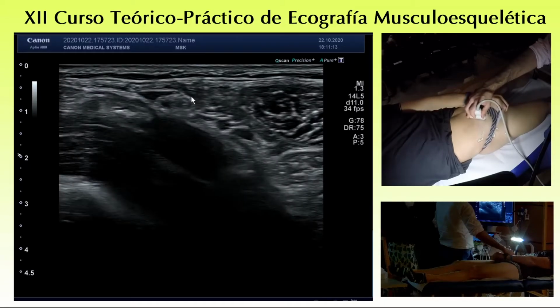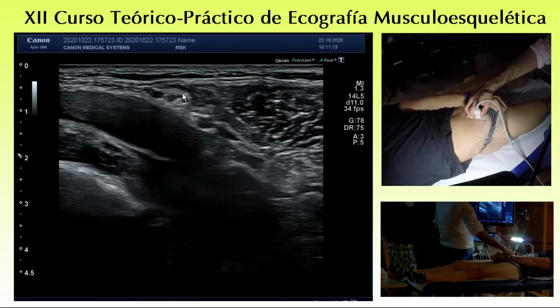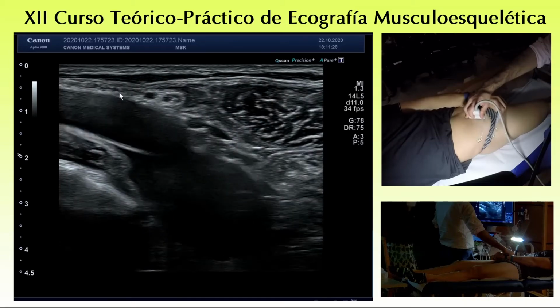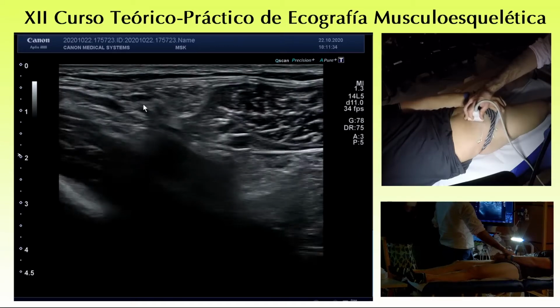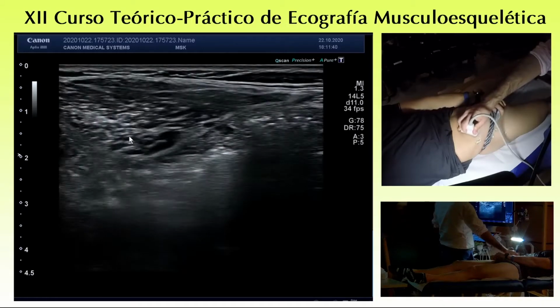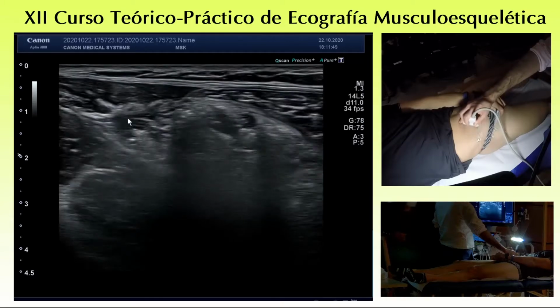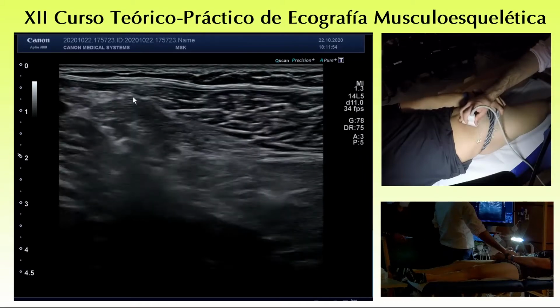Okay, this is the femoral artery. This is the content of the inguinal canal. And within all these fascicles, you have also some fascicles that could be related to some of the branches of the ilioinguinal nerve. But of course, the concept is that if I want to block, or if I want to see if there are any alterations, look for this interface. When you check this interface, then you can move proximally or distally to see if there are some branches maybe entrapped in some scar tissue of this area.